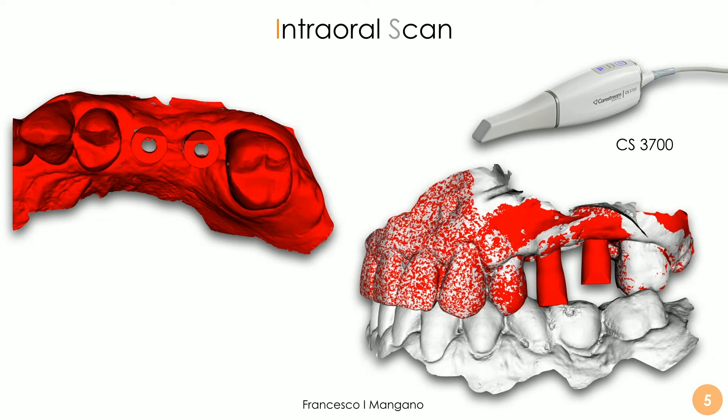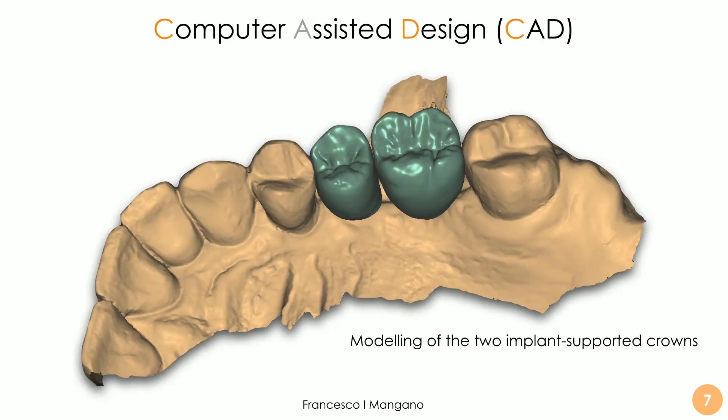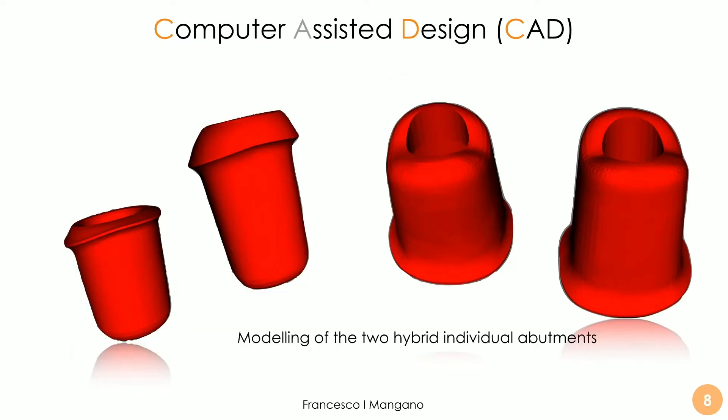The dental technician receives this scan — the master model with and without the mucosal collar and with and without the scan bodies — and is then capable to model the restoration. In this case, two implant-supported crowns supported by individual hybrid abutments that are also designed inside CAD software. These individual hybrid abutments are usually milled in zirconia and then assembled and cemented extra-orally on a titanium base. This is how we proceed with monolithic restorations, which are usually in zirconia or lithium disilicate in the anterior area.